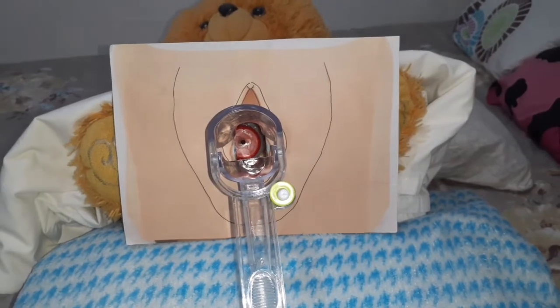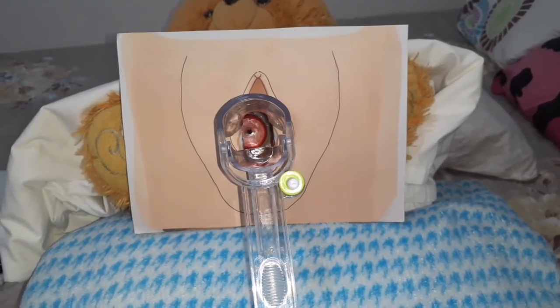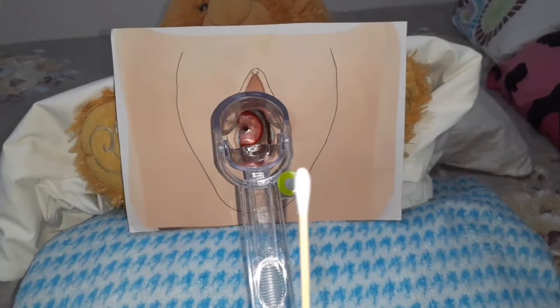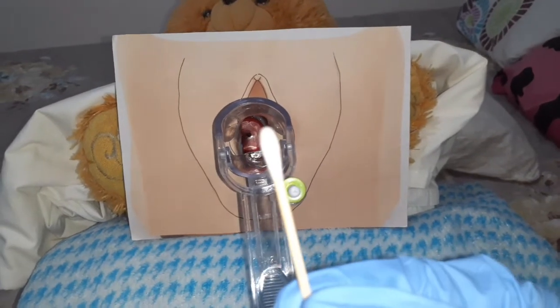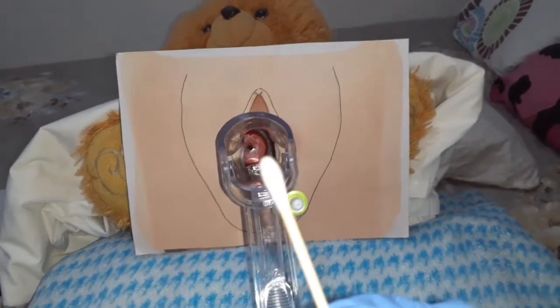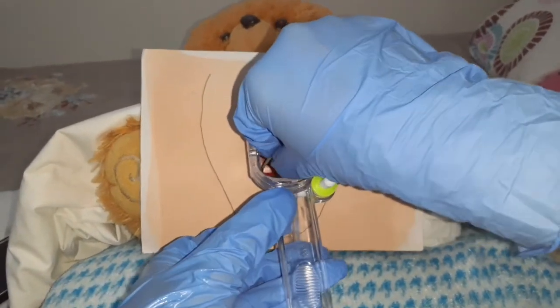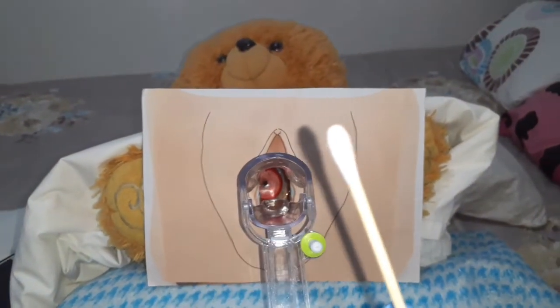Now we're going to get an endocervical specimen. To do that, get a sterile cotton tip applicator. Then, wet it with saline. Let's assume that this is my saline. Then, insert this through the speculum to the OS of the cervix. Gently rotate, first clockwise and then counterclockwise. Then remove the cotton tip applicator.